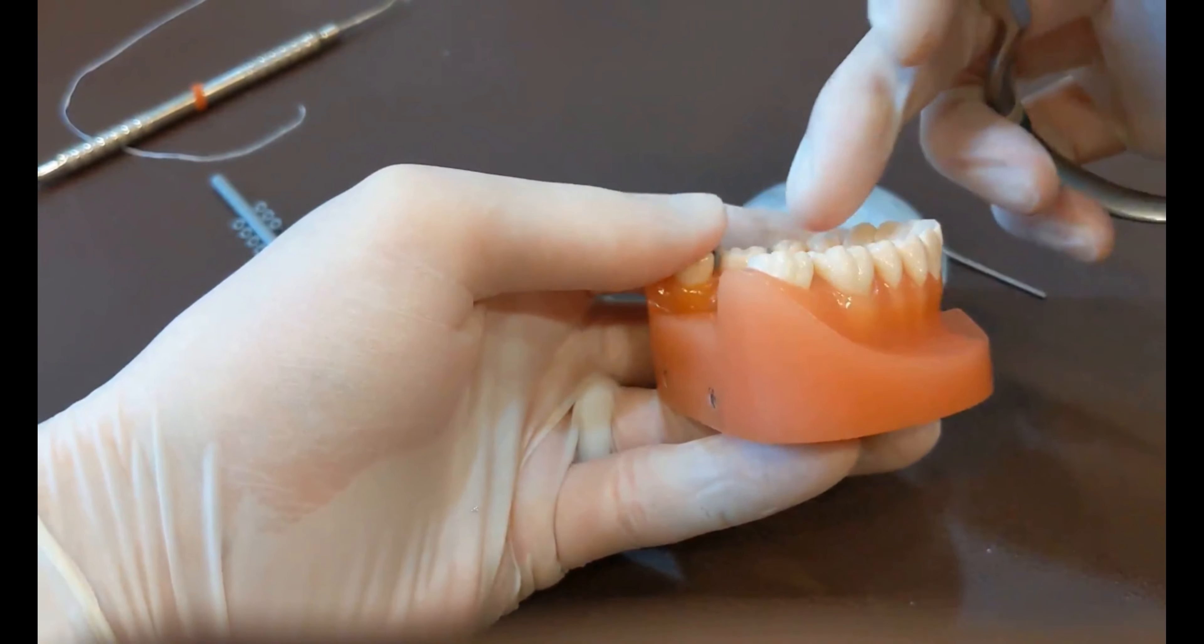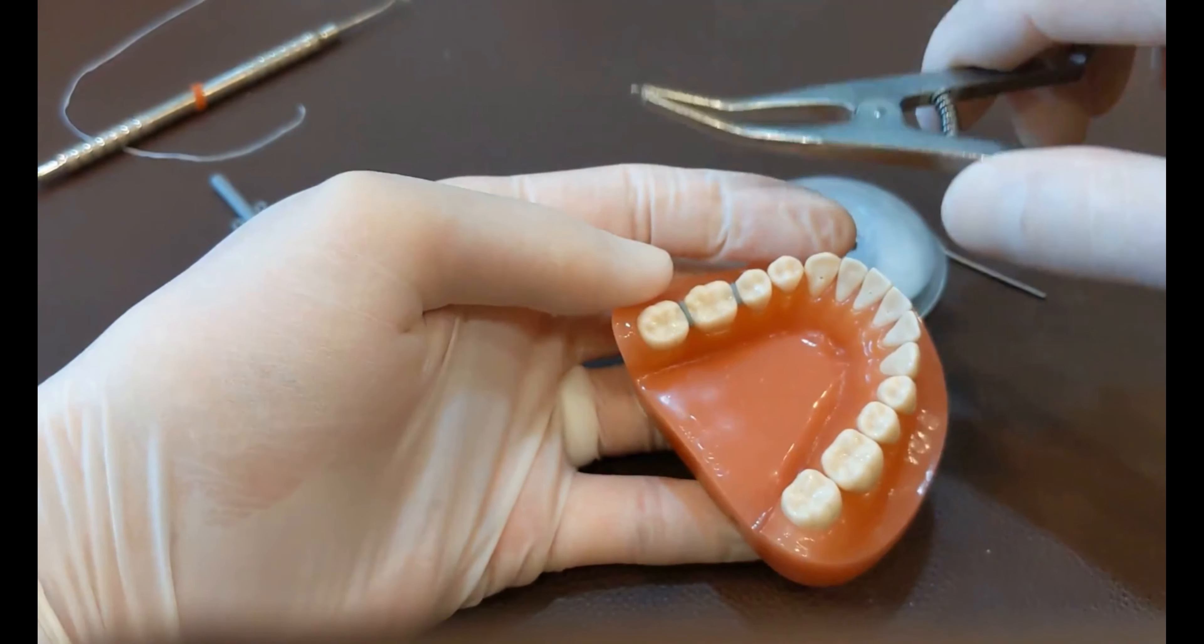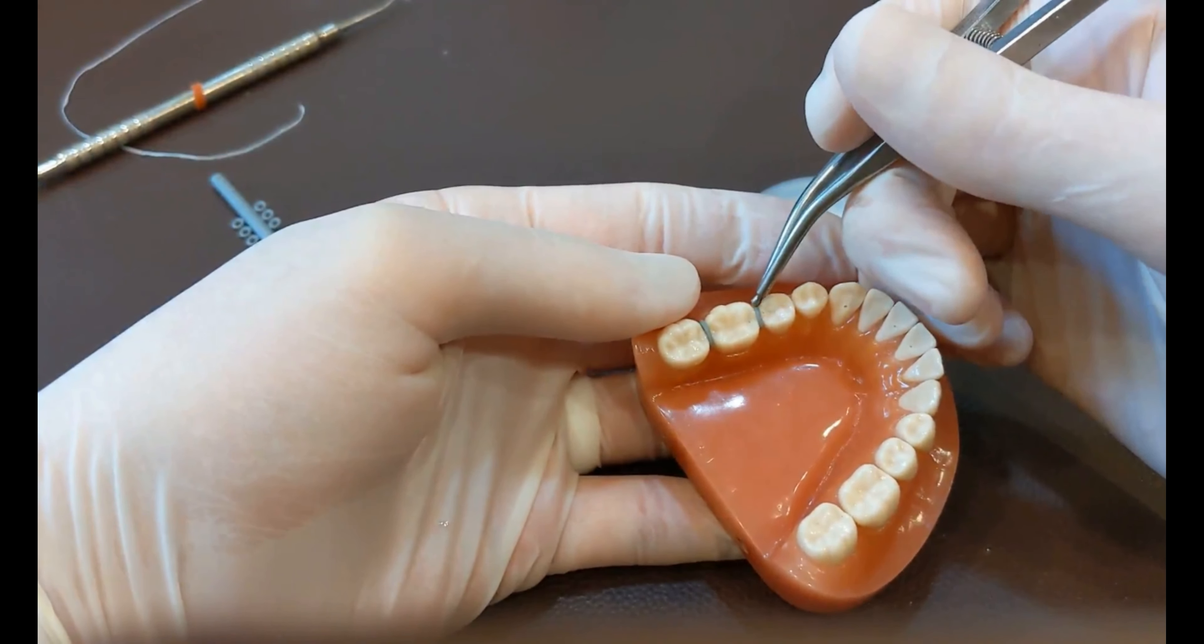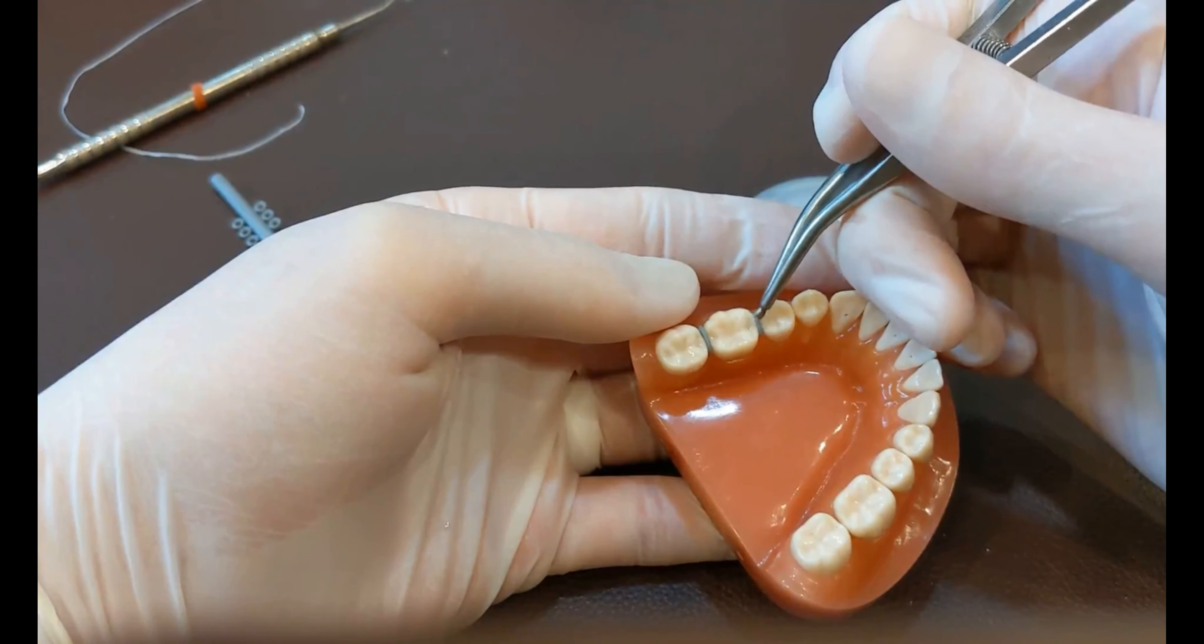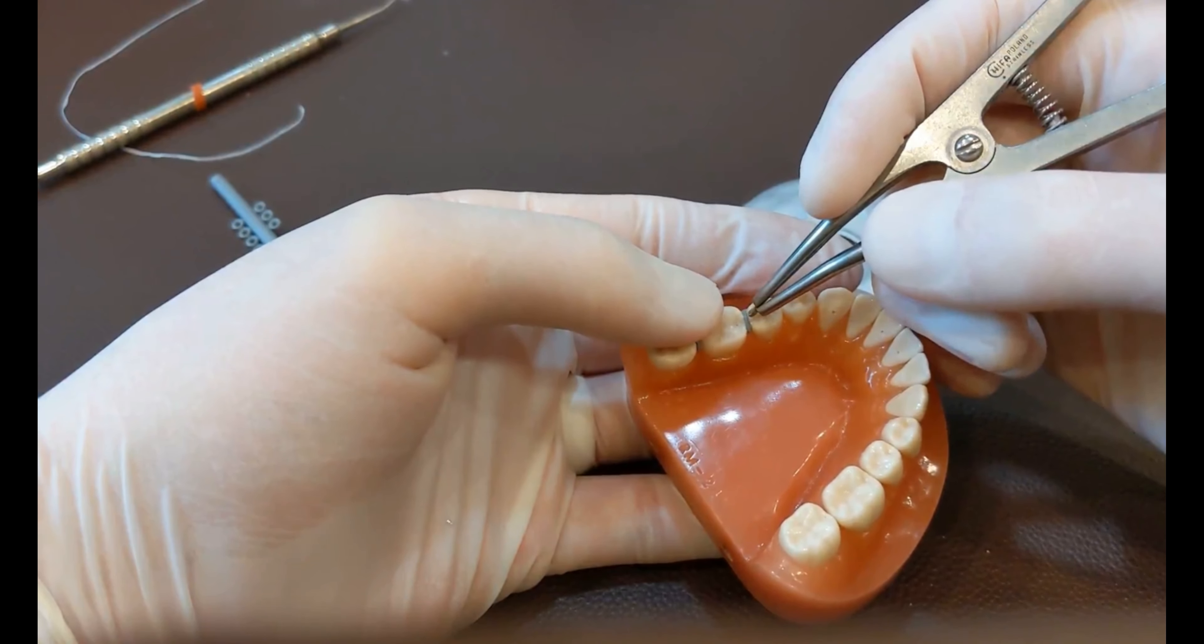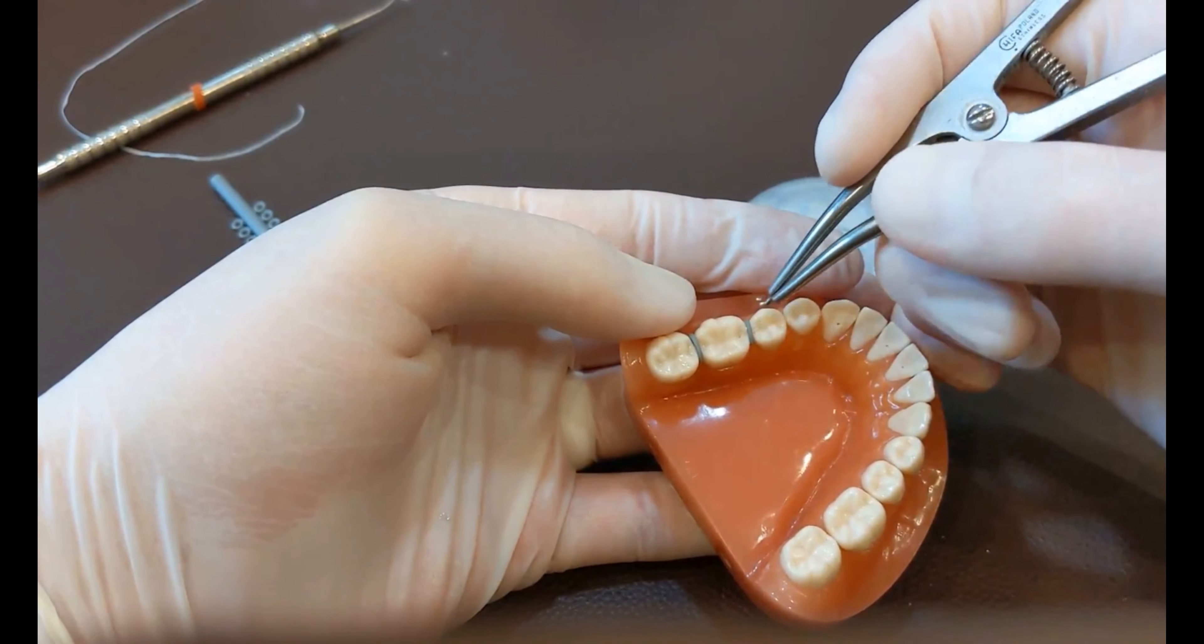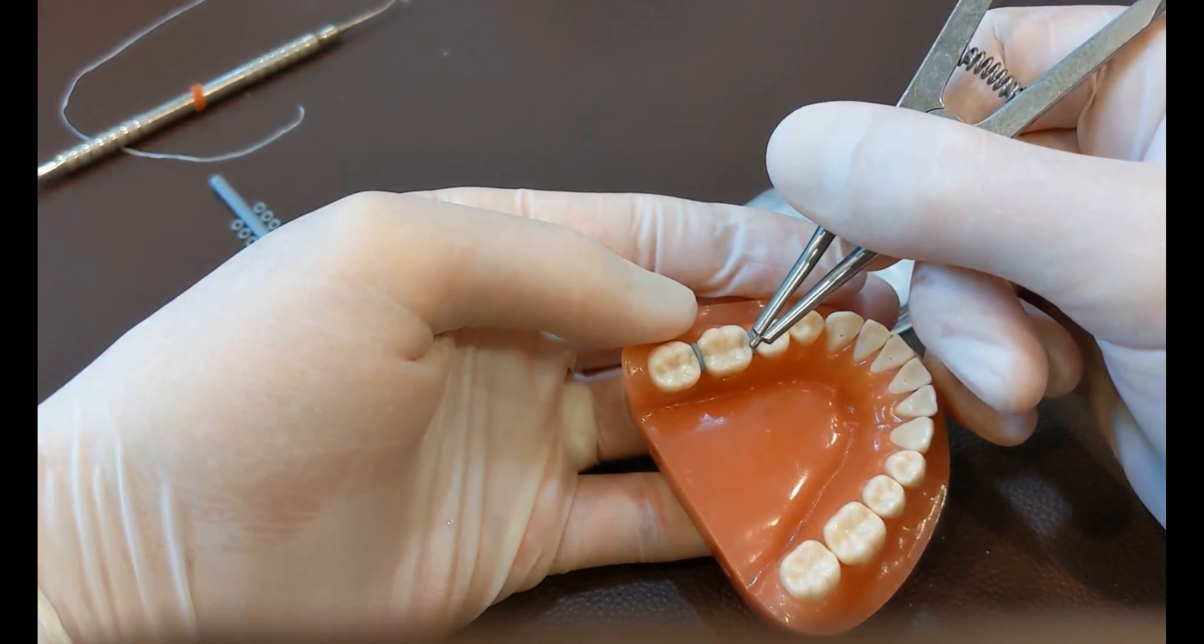So again, the idea is that half of it's below the contact and half of it is above the contact. If you use these or the floss, either one, just be careful that you don't overstretch the separator. If when you're done, the separator looks super loosey goosey and floppy, it's not going to open up that space and you're just wasting the patient's time. So if you overstretch it, pull that one out and put a new one in. You want it to be nice and snug around there. So that's how you use the separator pliers.